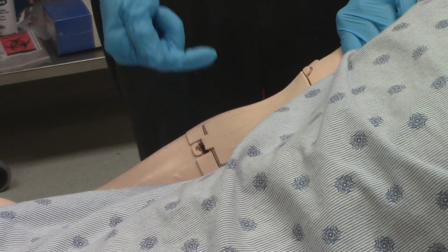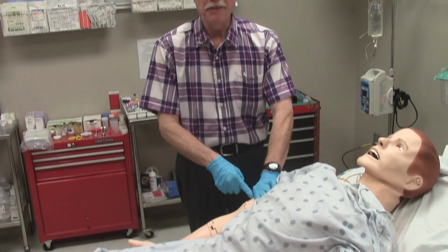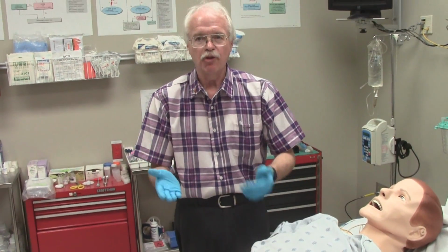Once your IV is in place, you can run fluid into the mannequin, you can push drugs. However, if you forget to take your tourniquet off first, your IV won't run. So you have to remember to remove the tourniquet from the mannequin. Fluids and medications that are put into the mannequin drain through a tube into a reservoir under the bed.